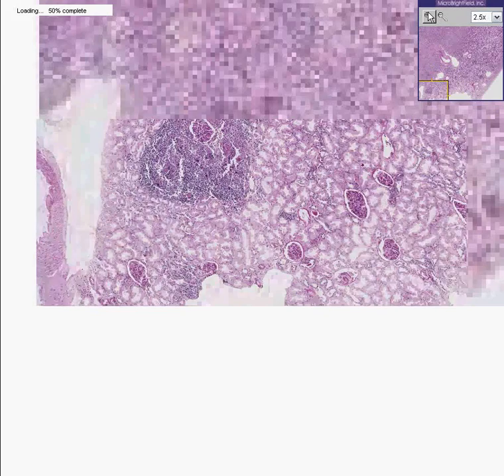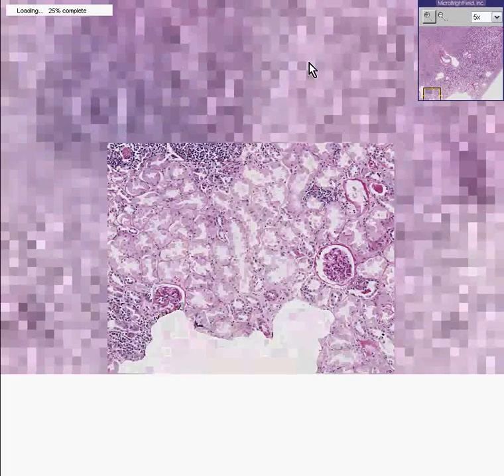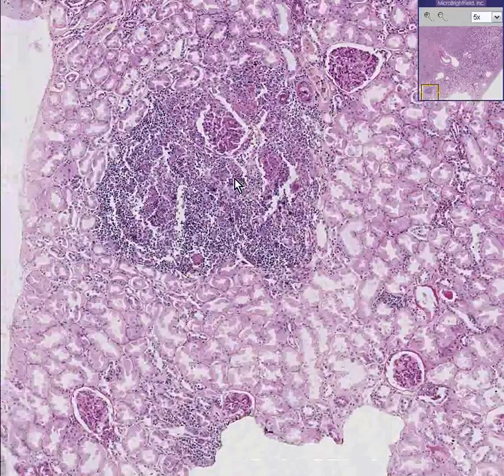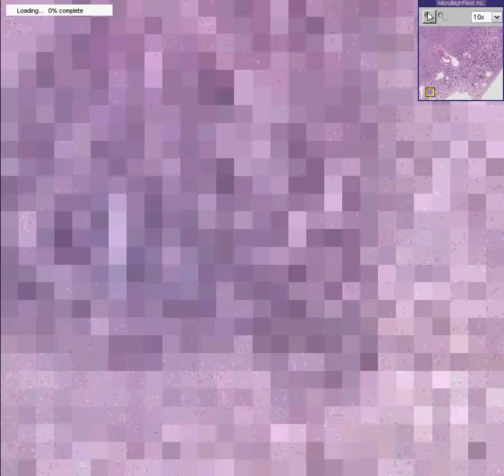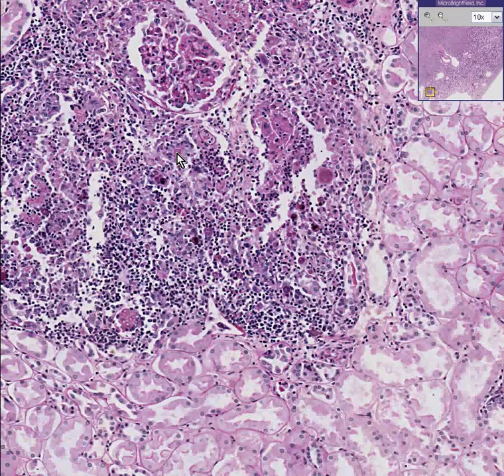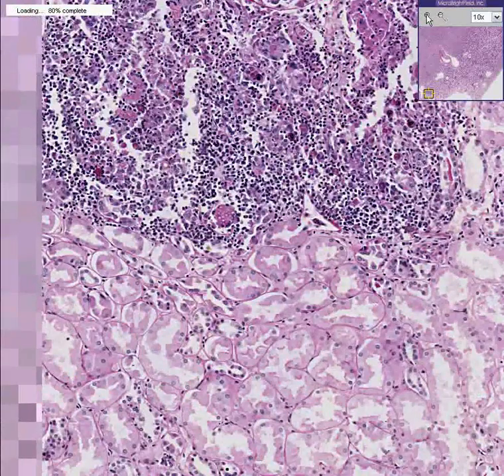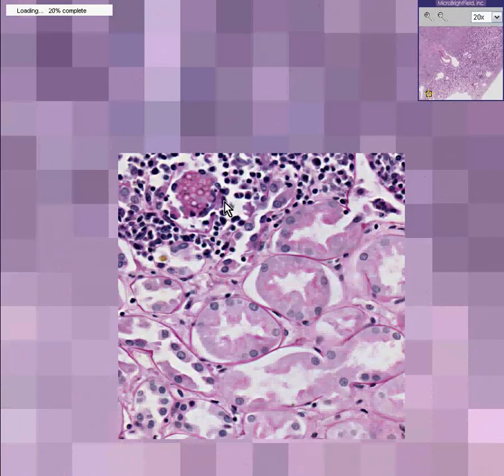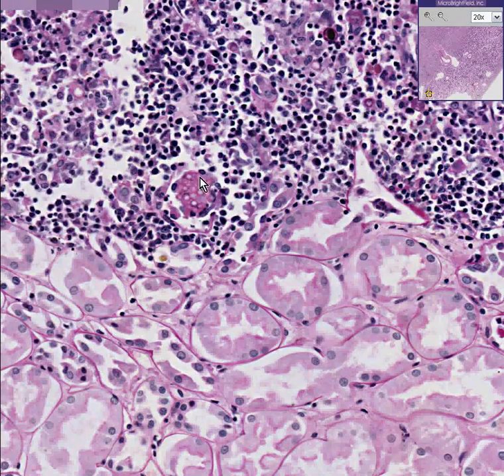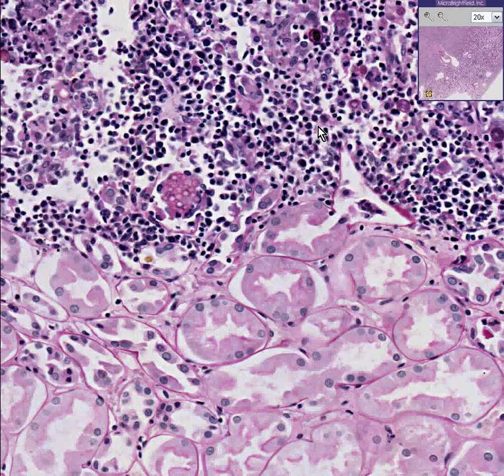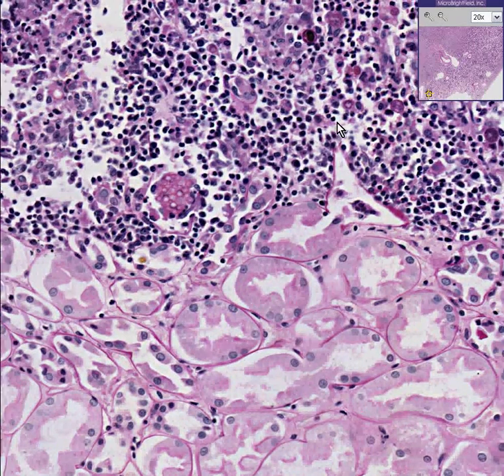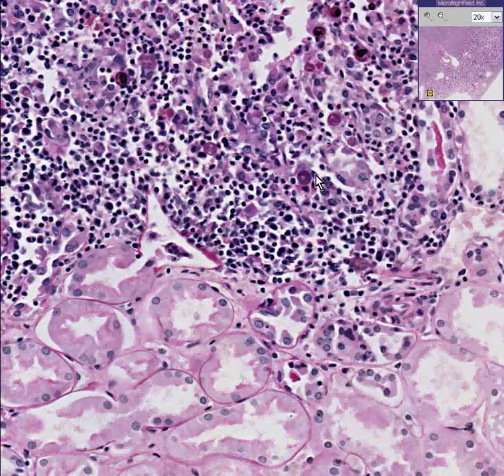Sure enough, you have some little abscesses here. Let's go in a little bit closer. Besides the fact that you see neutrophils and maybe some fibrin, if you look around not too much longer you can also see that there are little spherules filled with little balls, and because they are kind of red and this is a PAS stain, you already know these are fungi.